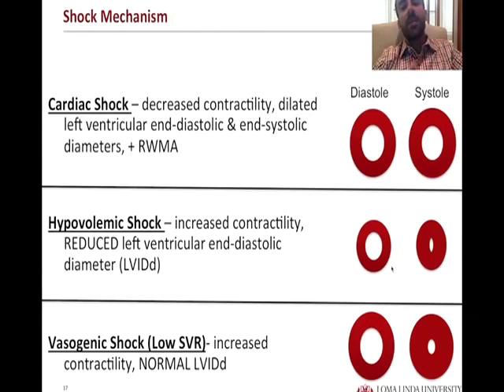Similarly, the assessment of hypovolemia is determined by assessing the expansion of the ventricle in diastole. So getting a true sense of the diameter or area change as it takes on more blood during the diastolic phase, and appreciating that increase in size is a good marker of determining volume status, overall preload status in your patient. In particular, it helps differentiate the possibility of hypovolemic shock, meaning that if your heart never expands much in diastole on point of care ultrasound, that is a warning sign and concern for the patient being hypovolemic.